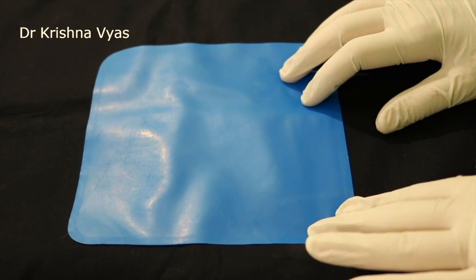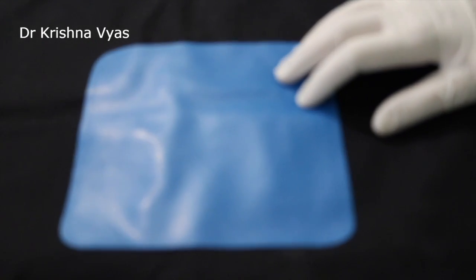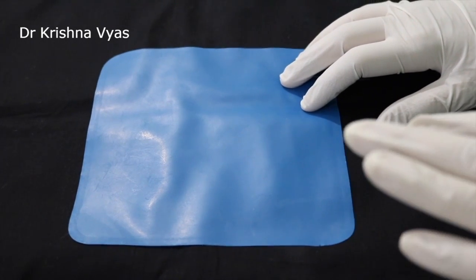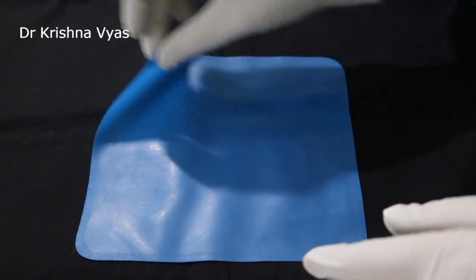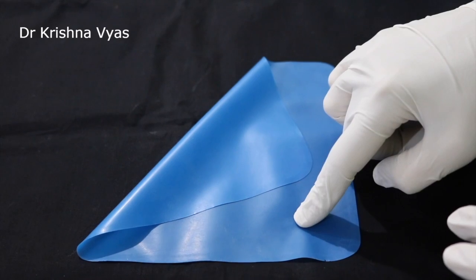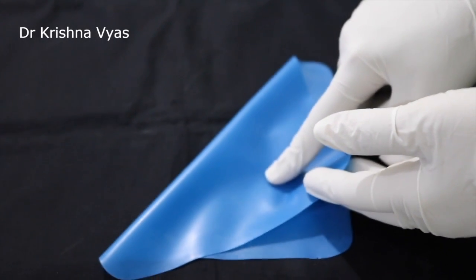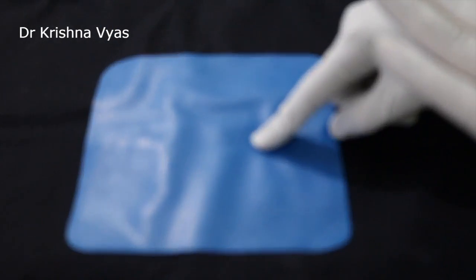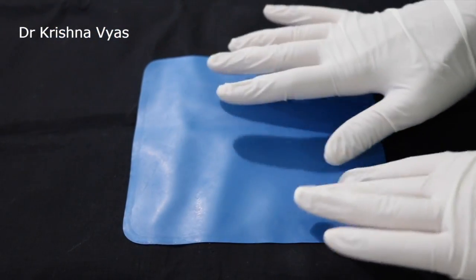The rubber dam sheet is available in different sizes like 4x4, 5x5, and 6x6 inches. 4x4 is for the pedo patients, and 5x5 and 6x6 can be used for the adults. The rubber dam sheet has two surfaces: one is a shiny surface, and the other is a dull surface. The shiny surface should always be facing the tissues, whereas the dull surface faces the outer side. It is also available in various thicknesses.